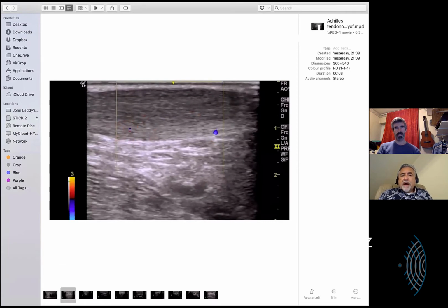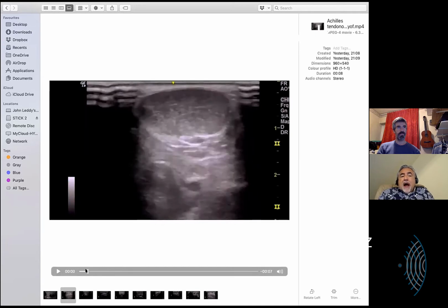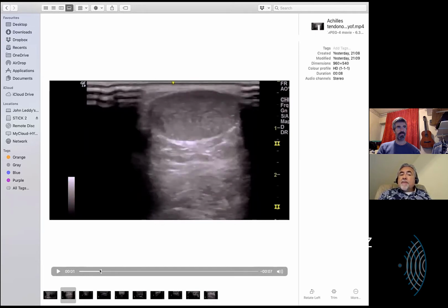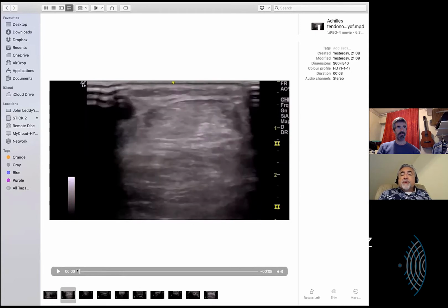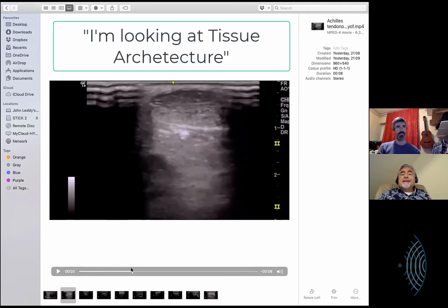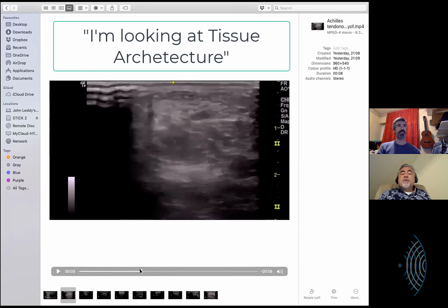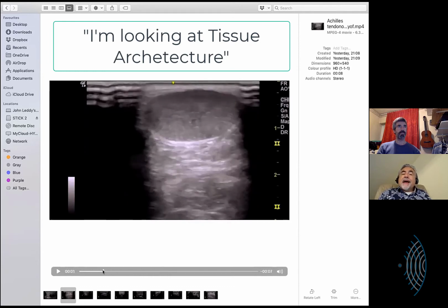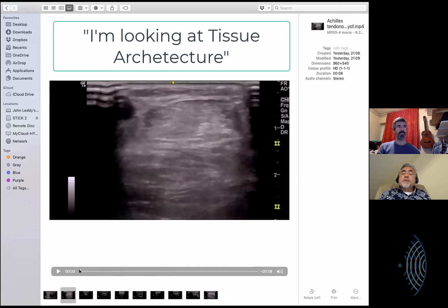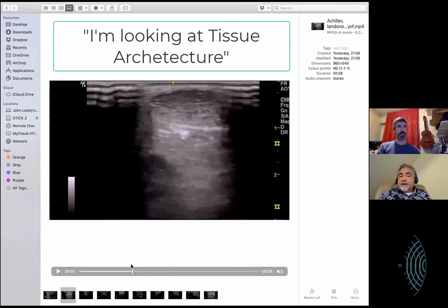So I would like to have your mind just basically talk the chatter that you would be looking at as your eyes would screen through what we call an elevator scan of the short axis. I'm always intrigued to see that spiral. I'm also taking a look at what the research shows in a couple of studies about the homunculus, the representation of which muscle bellies go to what part of that. What happens in your mind? Are you seeing medial gastrocs and soleus fibers as you look at it? Or are you just looking for echotexture of pathology?